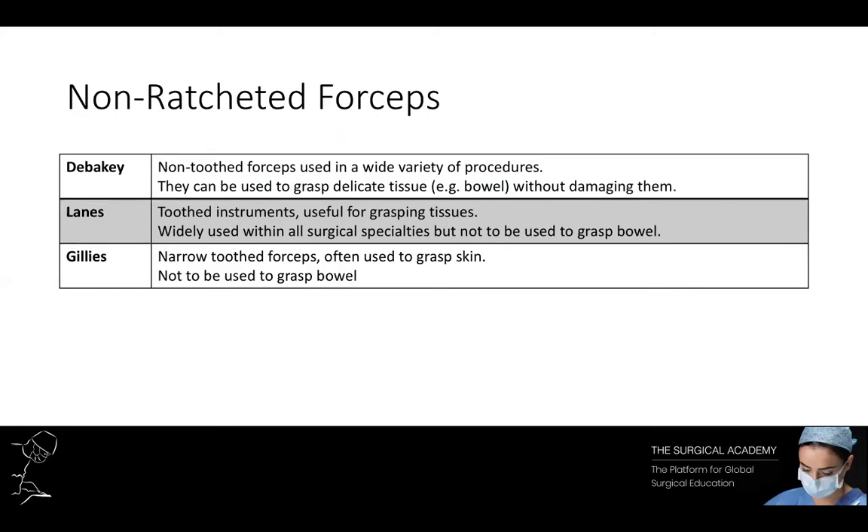The next type of forceps are non-ratcheted forceps. There are three very common examples: DeBakey, Lanes, and Gillies. DeBakey are non-toothed forceps and are used in a wide variety of procedures. The unique feature of DeBakey forceps is that they are able to grasp delicate tissue such as bowel without causing damage. Lanes forceps have teeth and are therefore useful for grasping tissue, but they are absolutely not to be used when grasping bowel. Gillies forceps are narrow toothed forceps and can be used to grasp skin. Like Lanes forceps, these are not to be used when grasping bowel.